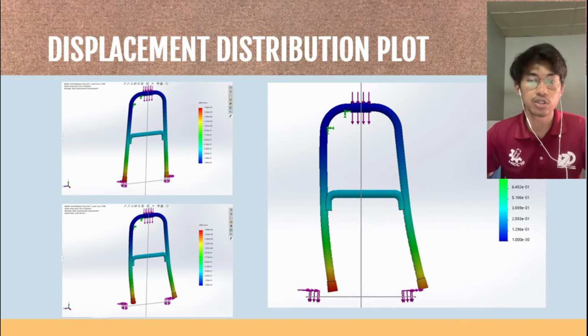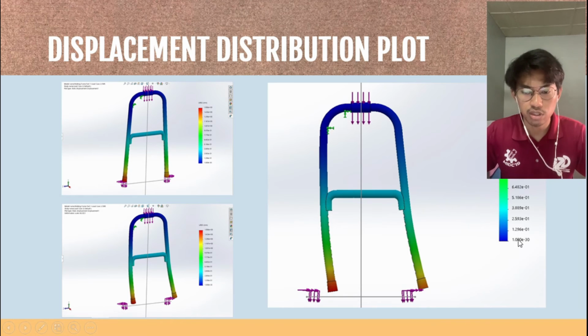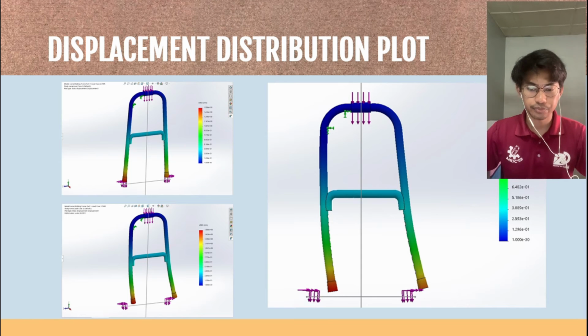So we move to the displacement distribution plot. It looks like the von Mises stress distribution plot. The brighter color indicates that the displacement is greater compared to the darker color. So the greater displacement occurs at the tips of the legs of the worker frame because they experience a friction force. This is because the friction force will always oppose the movement of the worker frame. So that's why it has greater displacement compared to the other parts of the worker frame.